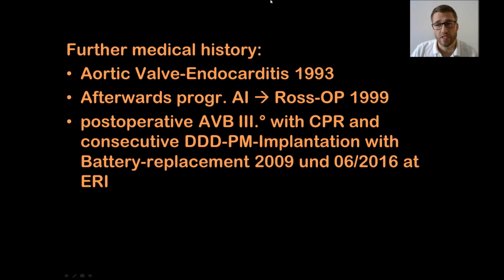Postoperatively, the patient suffered from a total AV block, AV block 3, with the need of CPR and consecutive implantation of a DDD pacemaker, with battery replacement in 2009 and June 2016 at ERI, elective replacement indication.